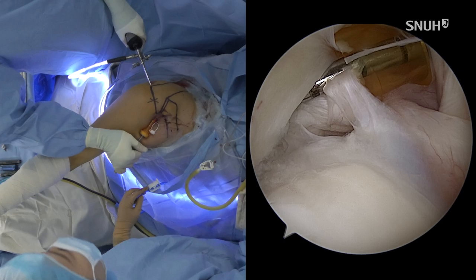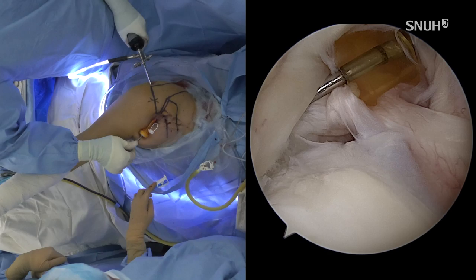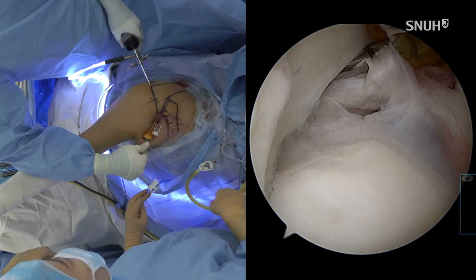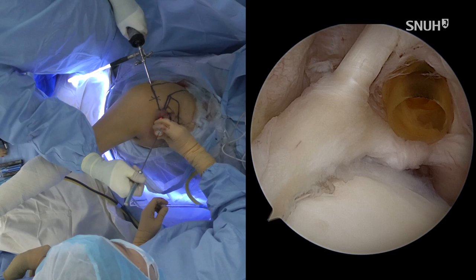So indirect decompression is enough for this kind of lesion with a type 2 SLAP lesion. So I will repair this SLAP from now on.